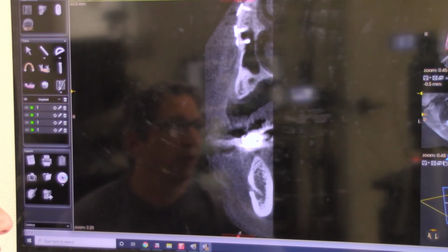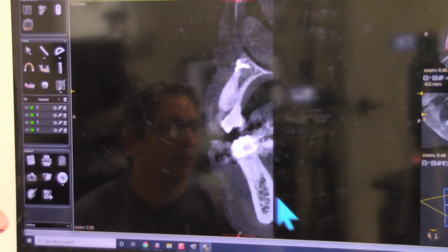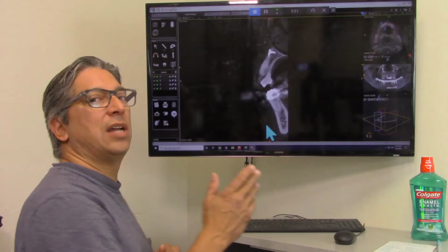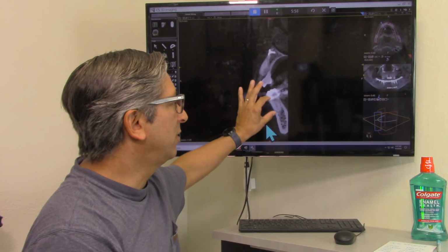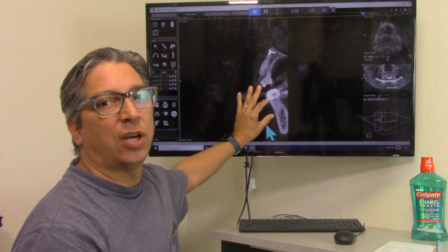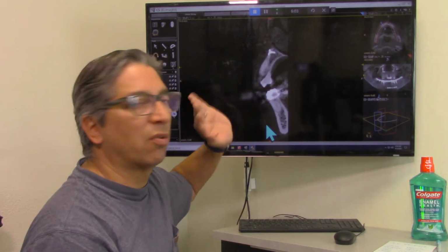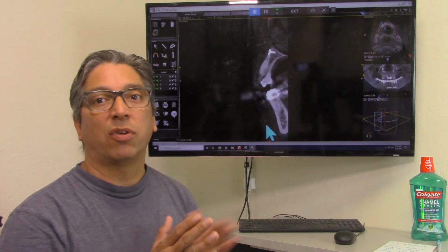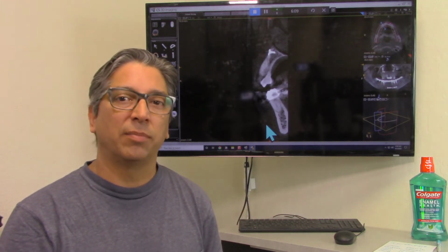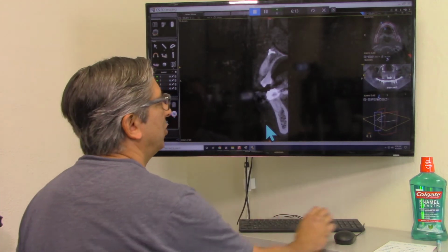And then when we come across the teeth here, we are looking at a little more density, but this is for sure when this gets extracted. This is not an immediate placement case. On this one, you definitely have to graft it, try to preserve that amount of bone when these lower teeth fail. And really, you're looking at a 4-locator denture piece on the bottom. So hopefully we don't see that anytime soon.